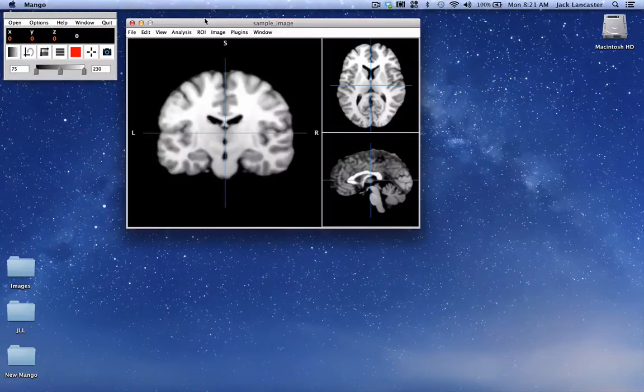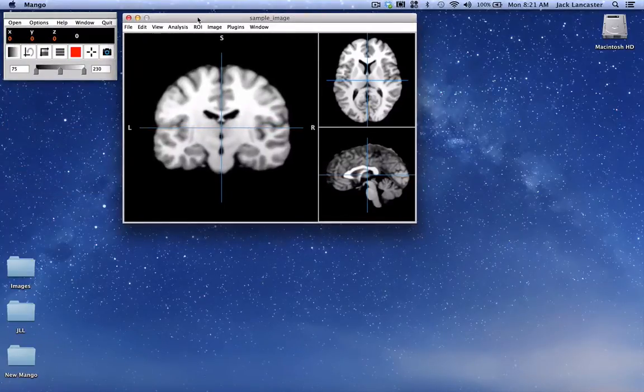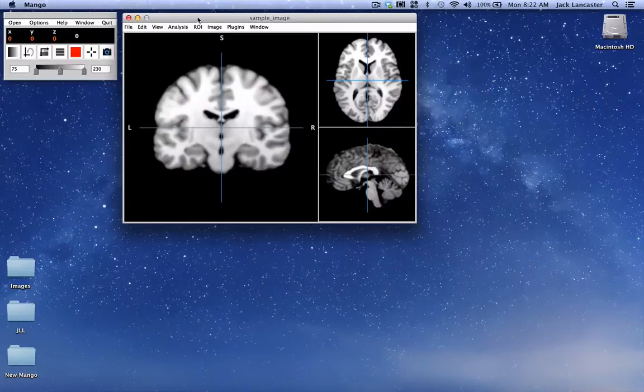There is now a sample image so that you don't have to find an image to begin using Mango.